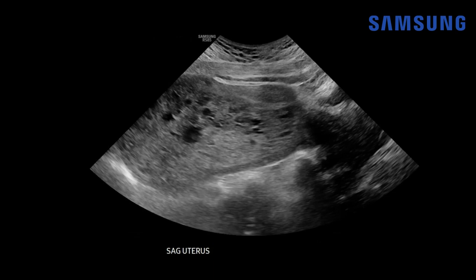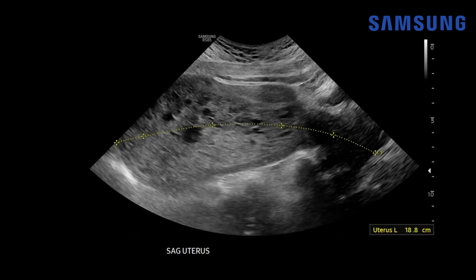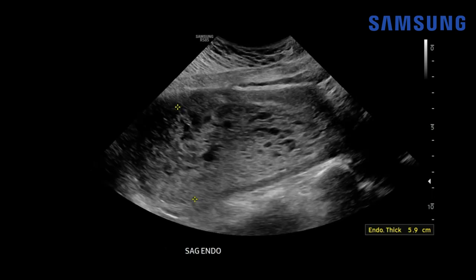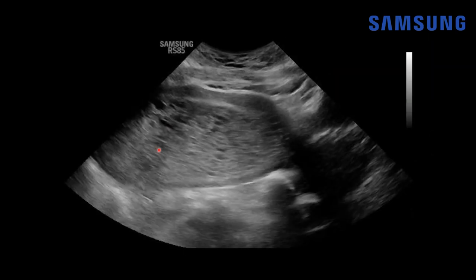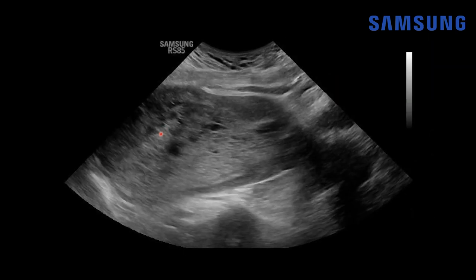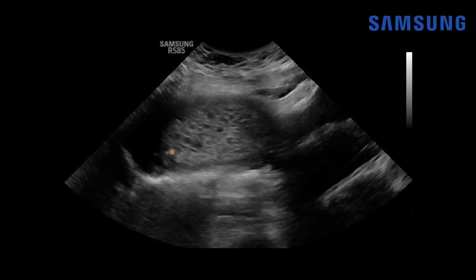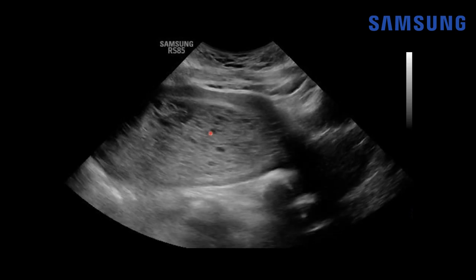Moving on to the sagittal images, the uterus is severely enlarged, about 19 centimeters in length. Here's the uterine fundus up here, the body, and then the lower uterine segment. The endometrial cavity is markedly thickened, measuring nearly six centimeters, and we're seeing some scattered areas of vascular flow within it. We don't see any normal fetus — just this expanded endometrial cavity with all these small cystic spaces.